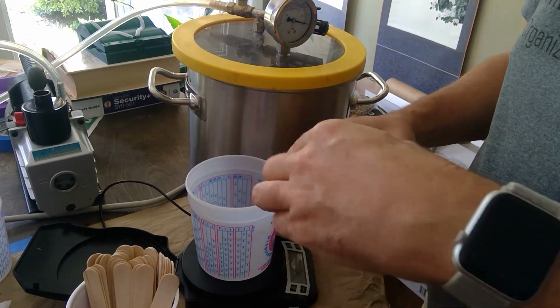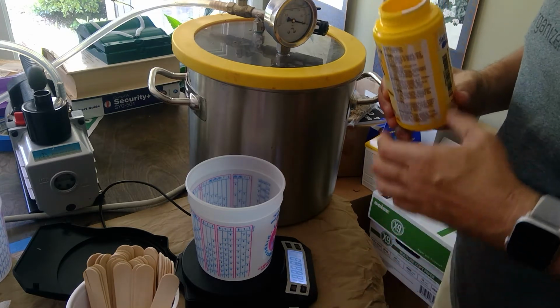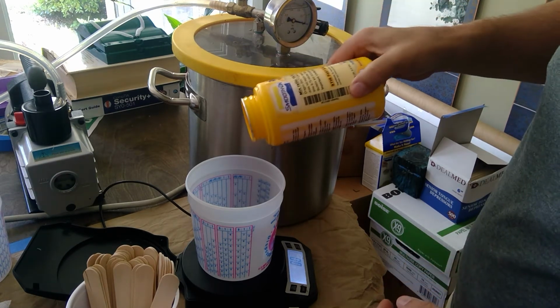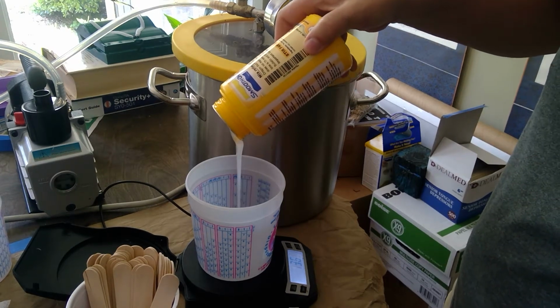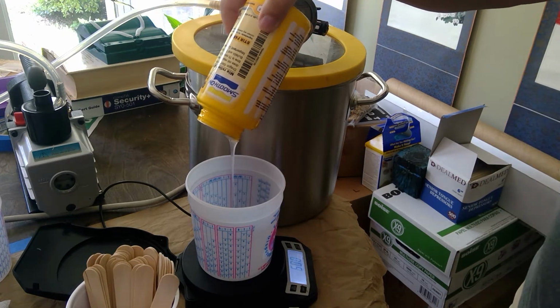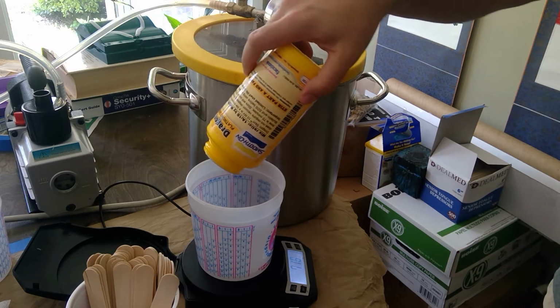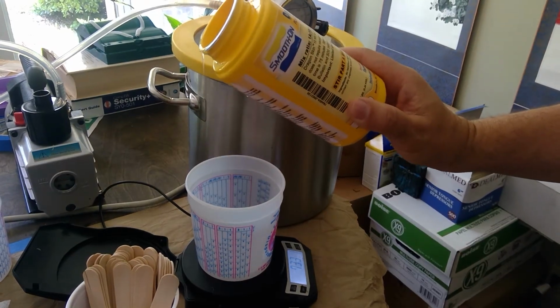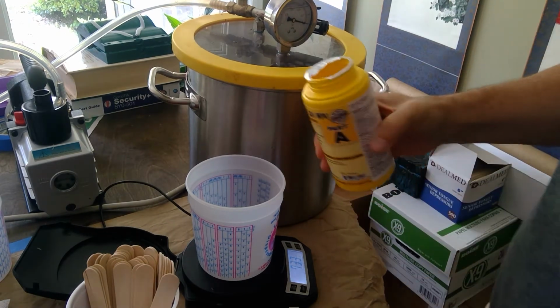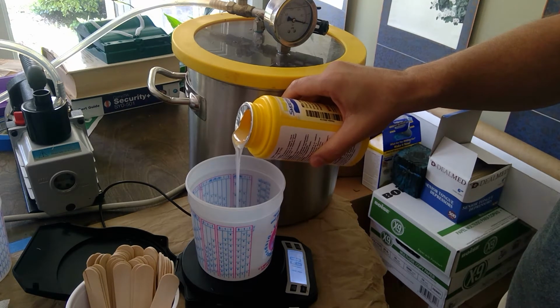Okay, so first we start with part A. We turn the scale on, wait for it to zero out. There you go, 0 grams, and then we pour this in. We were a little bit short with the first bottle, so fortunately we had a second bottle, so we were at 73 grams.